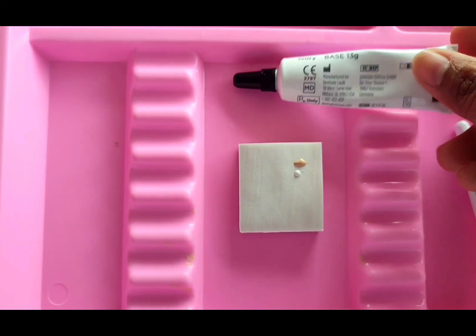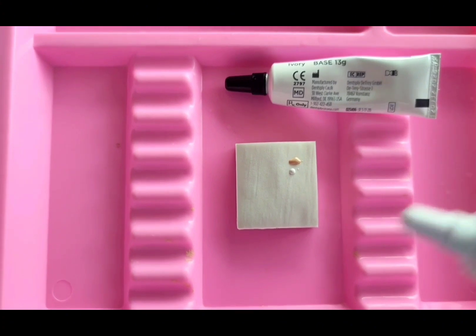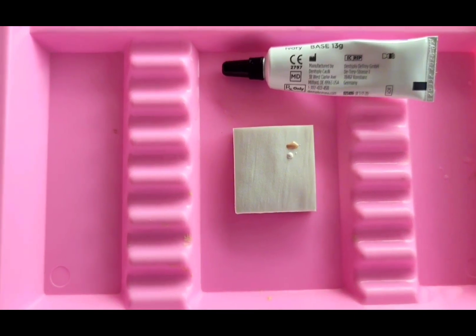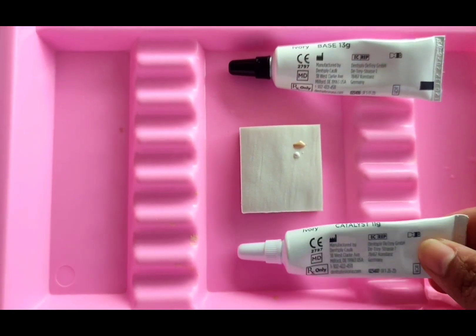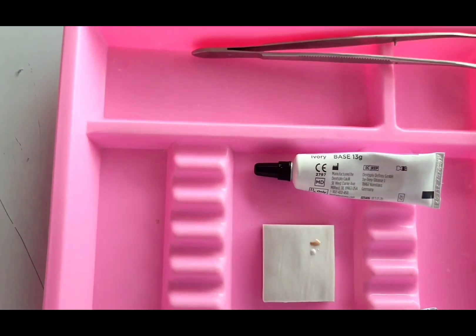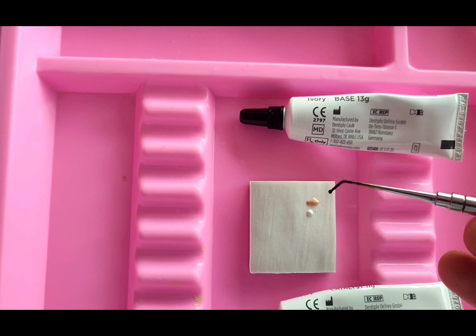The solubility and essentially basic nature of Dycal liner composition requires that it be used only in situations where it can be adequately protected from the oral environment. After the Dycal liner has completely set, cover with cavity varnish, dentin adhesive, or restorative material. For application, use a ball-pointed Dycal liner applicator or similar instrument.